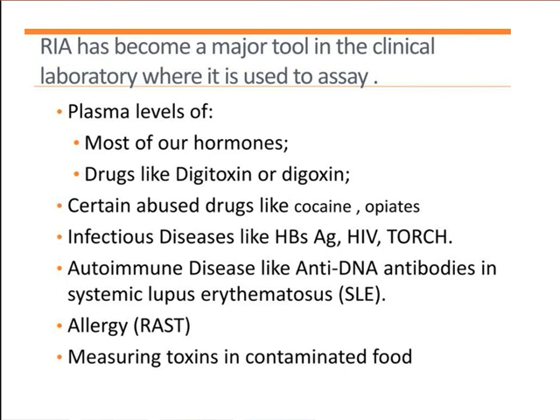So there are handling hazards because you are handling radioactive material, and sometimes if there is improper handling, if it gets into your blood, your thyroid gland may incorporate this radioactively labeled iodine. So there is such risk, but there are some merits. This is a very precise technique and this is an in vitro technique, so there is no damage to the cells or tissues.